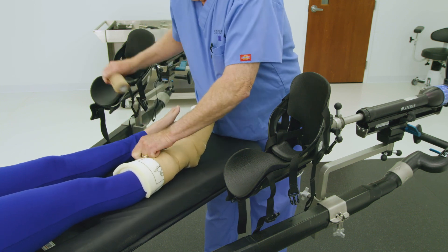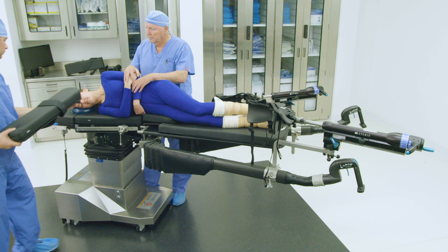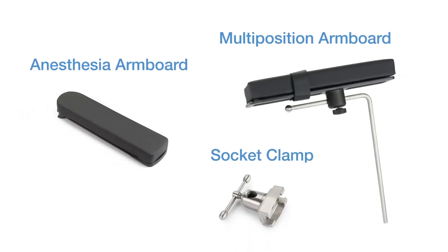Once the feet are prepped, it is time to position the patient in a lateral position. Using safe patient handling practices and AORN guidelines, roll the patient onto their side into the lateral position. Next, a standard anesthesia armboard and a multi-position armboard should be installed to position the arms on the non-operative side of the patient in the lateral position.